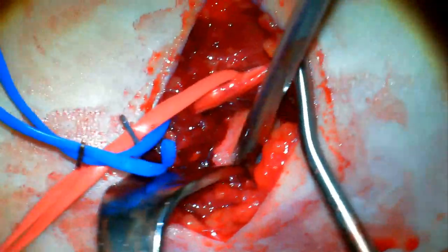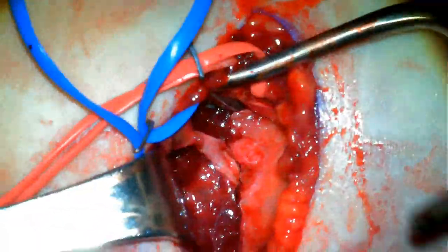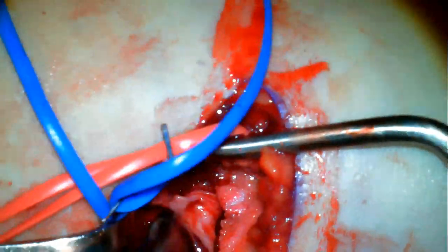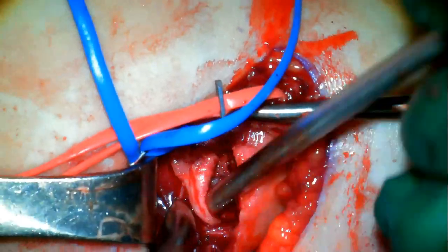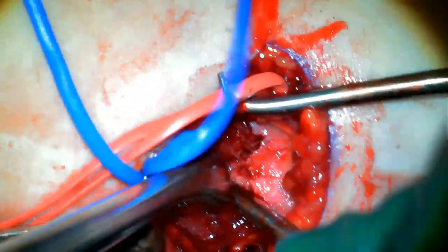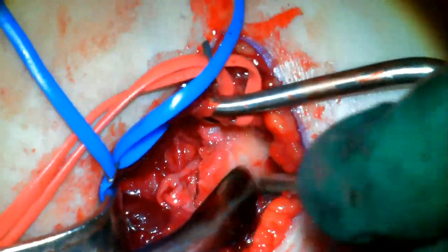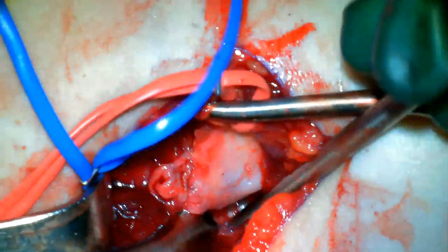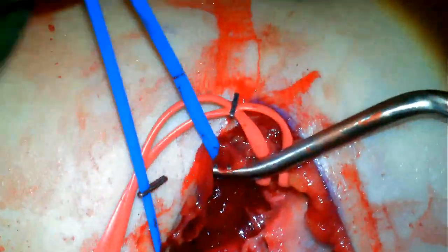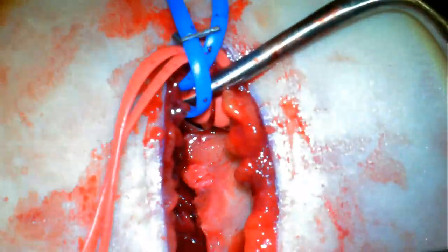Next we'll work medially to liberate that medial spike. Working medially, we just need to release everything that is preventing that medial spike from retracting back posteriorly into the periosteal sleeve from which it came. With the combination of the cob and the sucker tip, we're pushing the fragments laterally and retracting back, not allowing anything to drop down into the fracture site, and pushing the proximal piece into the periosteal sleeve.